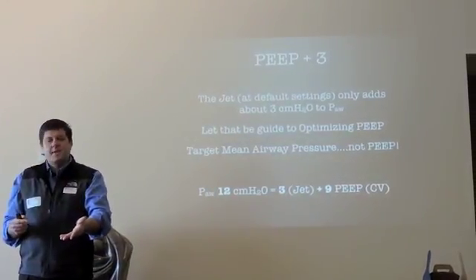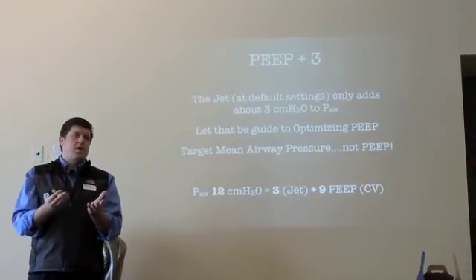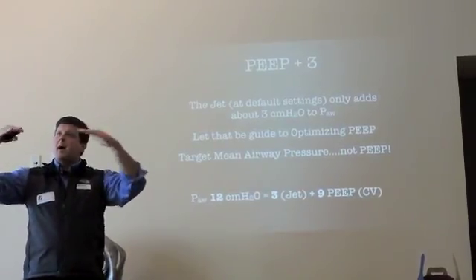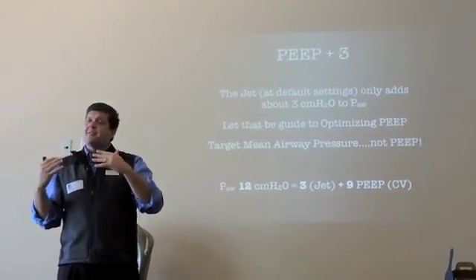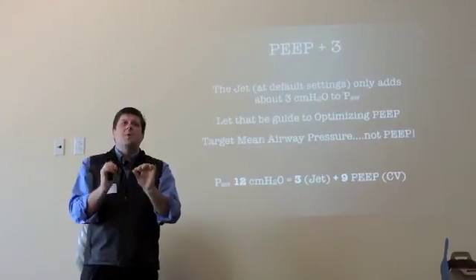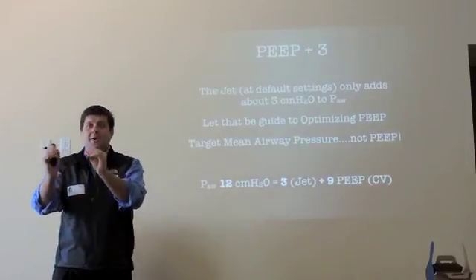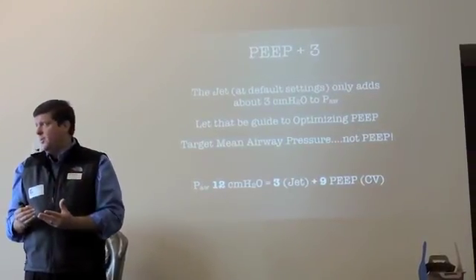So now you can catch this before it happens. You can realize that, hey, this PEEP of 6 or 7 that's ordered is way too low. When I first transition my patient to the jet, I aim for a higher mean airway pressure, get them stabilized, and then titrate it down. The way I always approach it is the ordered PEEP of 7 that you have, that's where you want to be. That's not going to be where you start. That's where you're going to be a little bit later once everything is stabilized. But if you start off there, it's going to be too low.